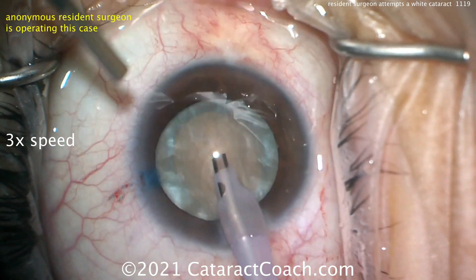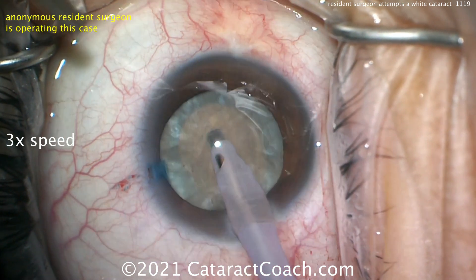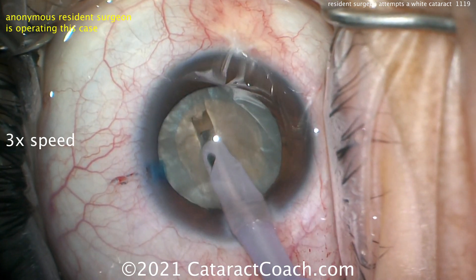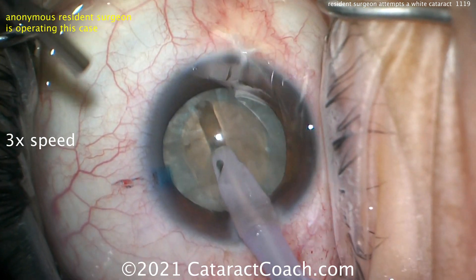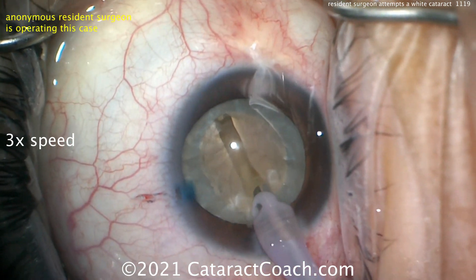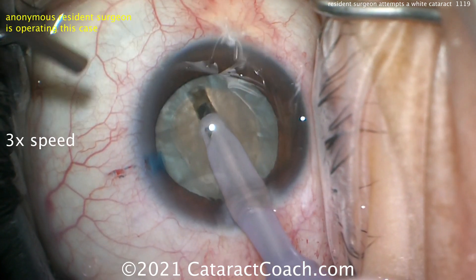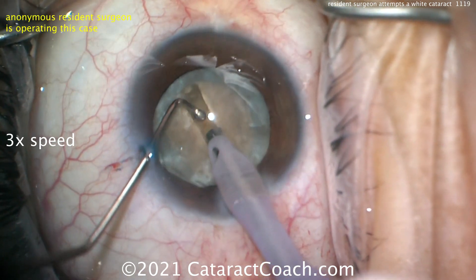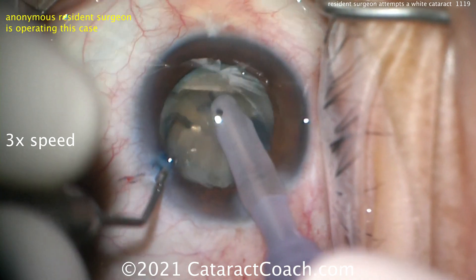The video has been sped up to three times normal speed so we can watch the entirety of it. Here comes the groove — that looks like a very nice groove. It looks like a divide-and-conquer or stop-and-chop technique. I like the groove being deeper in the center and shallower in the periphery, which is ideal. Remember, the cataract is shaped like an M&M — very thick in the center and thinner out toward the periphery — so the bottom of the groove needs to have the same curvature as the posterior aspect of the lens.